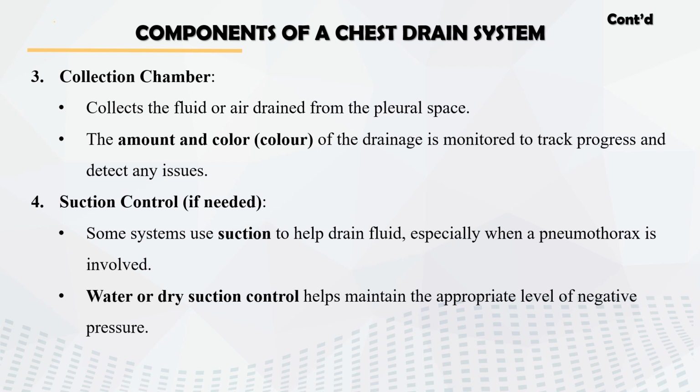Okay, water or dry suction control helps to maintain the appropriate level of negative pressure. Like I said before, the chest has a negative intrathoracic pressure, and the suction control helps to monitor and prevent backflow of air into the chest cavity.